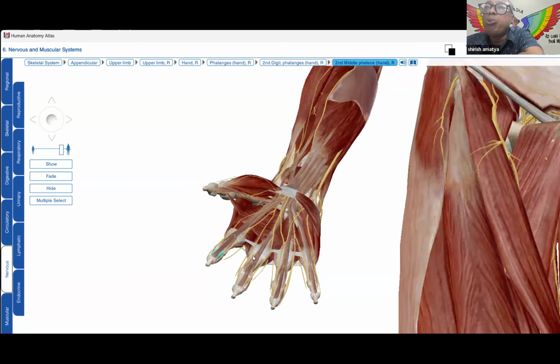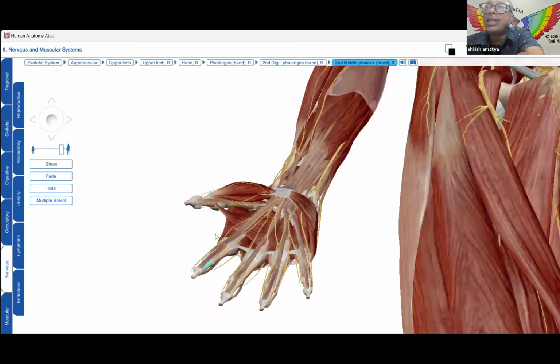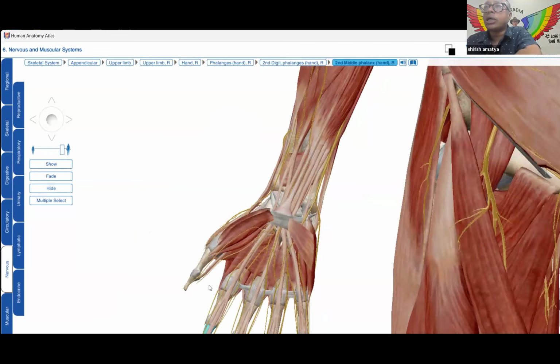These pulleys are unfortunately not shown in this 3D anatomy. I'll show you the first pulley in ultrasound, and maybe Dr. Smruti has slides where the pulleys can be nicely seen, both the annular pulleys as well as the cruciform pulleys. These are the main structures that will be seen in ultrasound. If there is any structure that you want me to repeat in this 3D anatomy of the wrist, please tell me before going to the sono-anatomy.